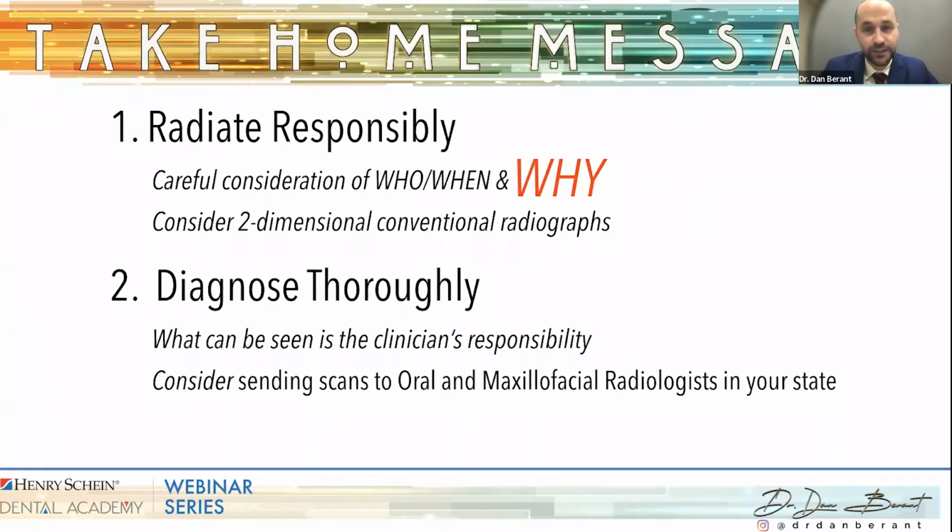And then finally, the importance of diagnosis. So a question that's often asked is, if I didn't see it or I don't know about the brainstem or the sinus, am I still responsible to diagnose it? And the answer in the court of law is undoubtedly yes, 100%. If you can visualize it on the screen through the X-ray, through the CBCT, you are responsible for it.